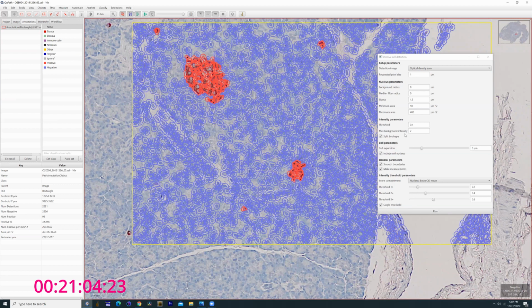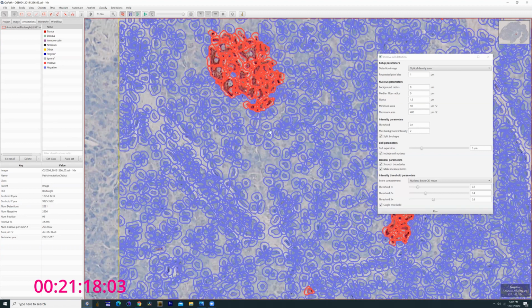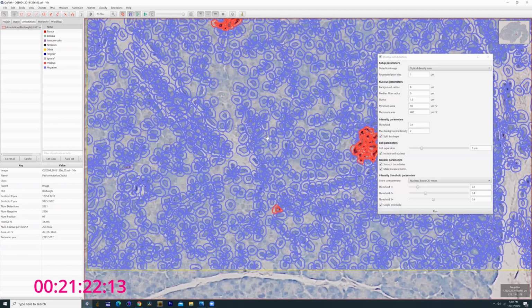So what you have to understand is the basic background it's pulling out, trying to estimate cell structure, the roundness of the structure, or the center of the nucleus, is based on where the threshold starts. As you can see within this, it seems to be missing, you know what, actually it's not doing a horrible job, but it's missing some of these internal structures.